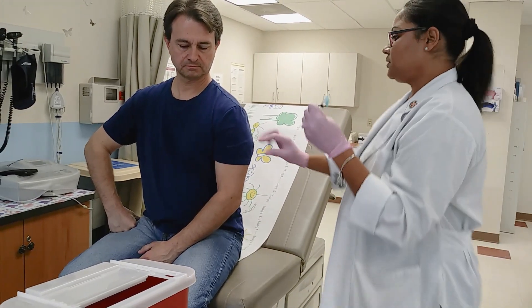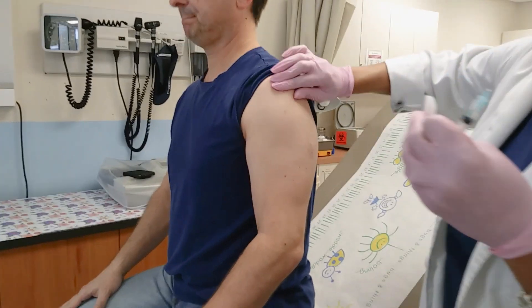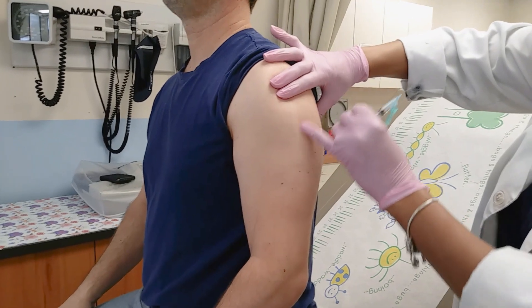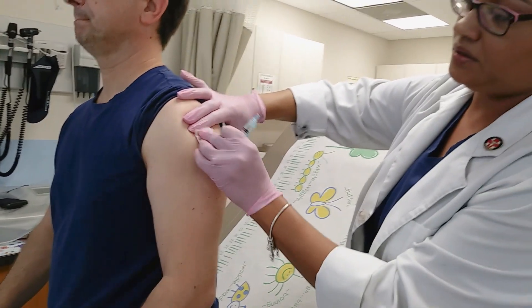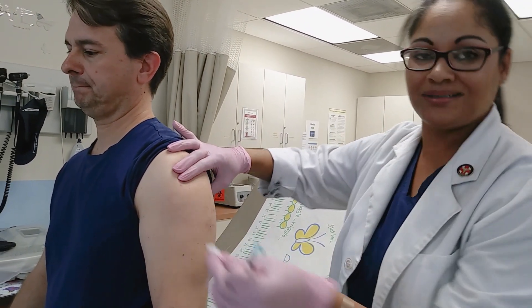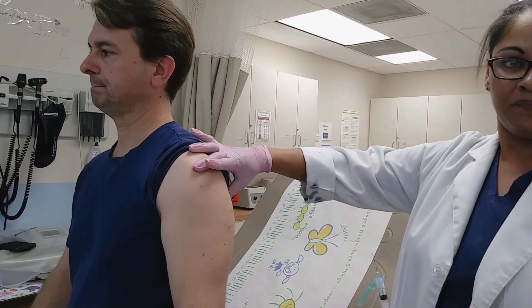We're going to find the acromion process — the bone right here — and come down two fingers below. We'll make sure we don't have any discolorations of the skin, any tattoos, or anything like that. We're going to clean from the inside to the outside in a circular motion and give it time to dry. Remember, if the alcohol doesn't sit on the skin for at least 30 seconds, it's not going to do any good.